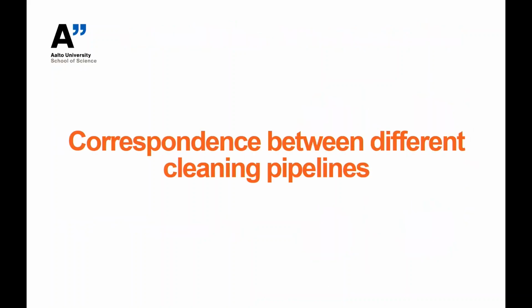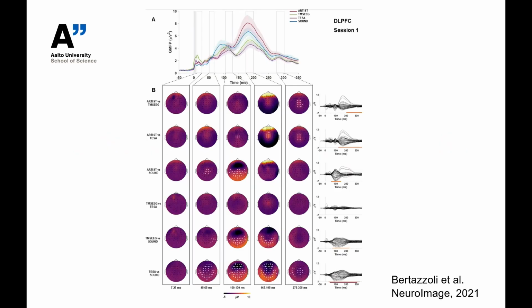And then I think I still have a couple of minutes. What we have paid a little more attention to recently is that many research groups, also in the TMS-EEG field, are using their own custom scripts and quite complex cascades of cleaning processes or pipelines. So how reproducible are the most popular TMS-EEG pre-processing pipelines? In short, I can tell you that they are not really reproducible.